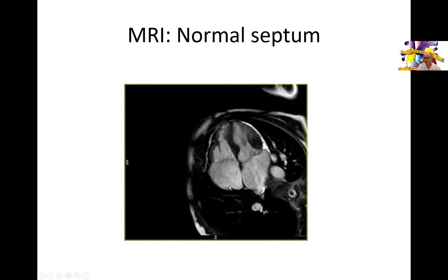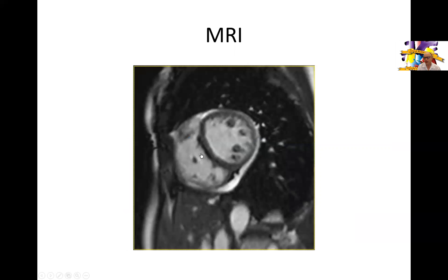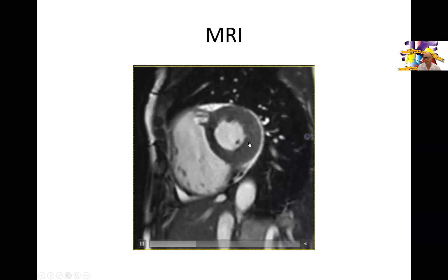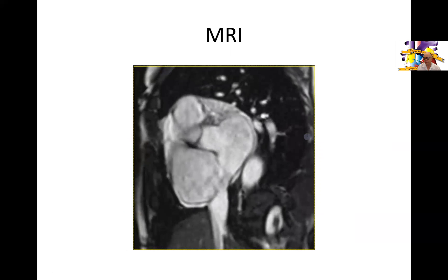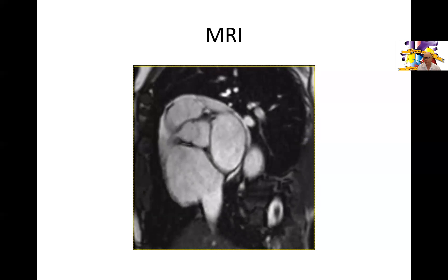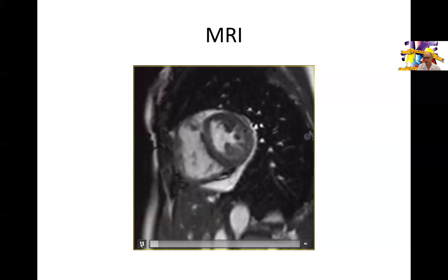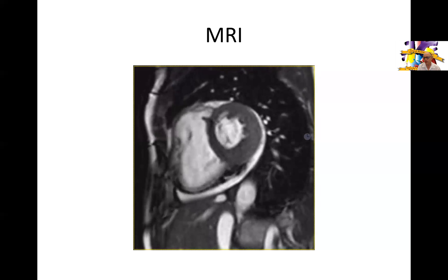An MRI was done on this patient to ascertain where the shunting is happening and to get a better assessment of the right ventricle. You can see the right ventricle is slightly dilated. In the next view you can see the coronary sinus now clearly linking the left atrium to the right atrium, indicated by the arrow. If you let this play you can see that connection displaying itself in this area — the coronary sinus acting as a conduit between the left atrium and the right atrium. The coronary sinus is normally supposed to drain the venous flow of the heart and should have no connection to the left side, but in this instance it connects the left atrium to the right atrium, acting as a form of atrial septal defect.